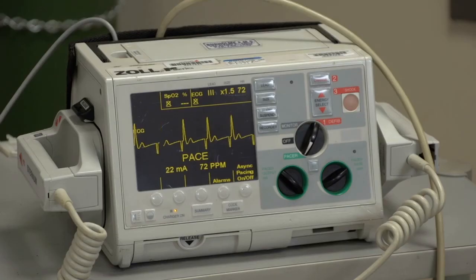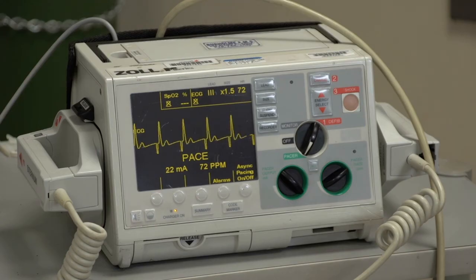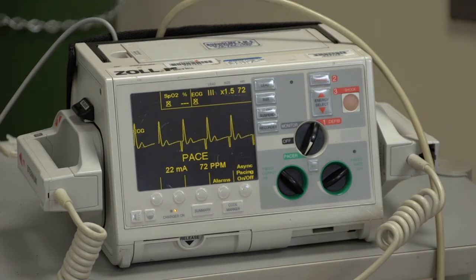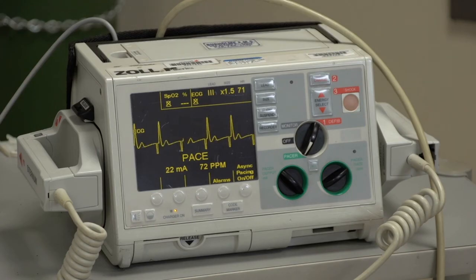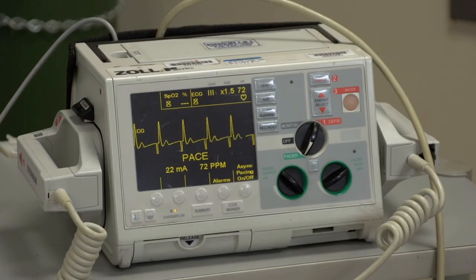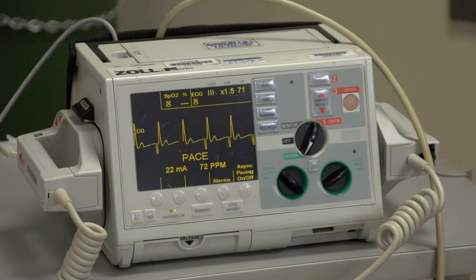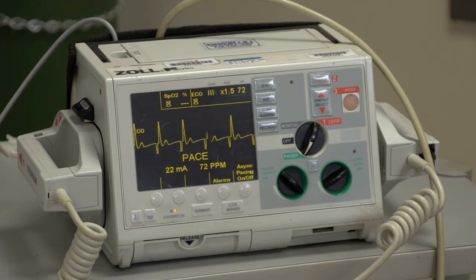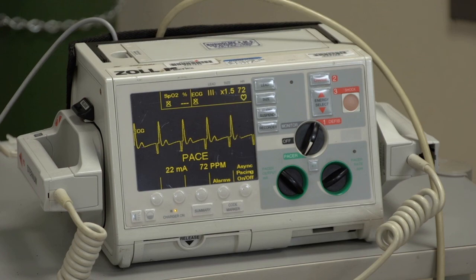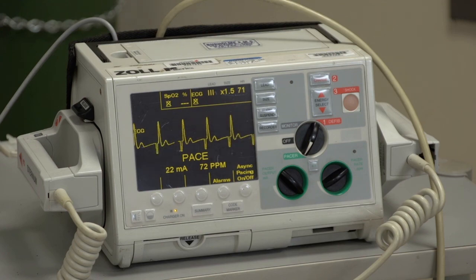Check the rhythm on the monitor. If the rhythm remains ventricular fibrillation or pulseless ventricular tachycardia, do two minutes of CPR and shock again. Increase the energy to the maximum energy level.